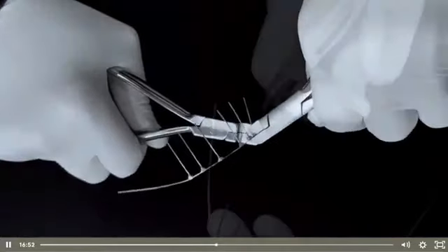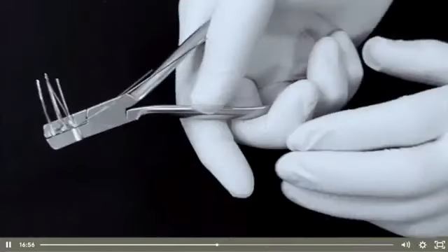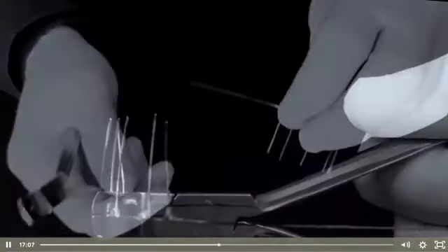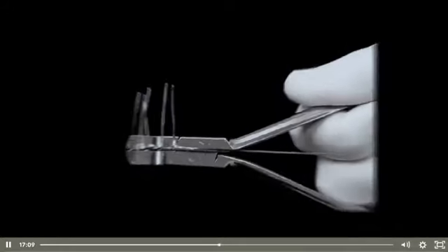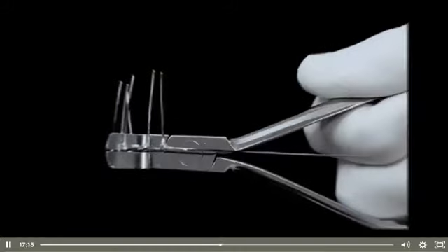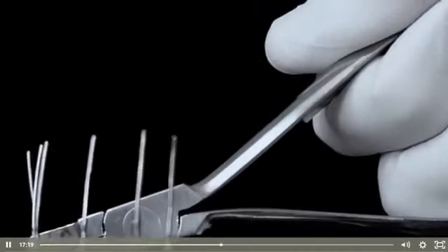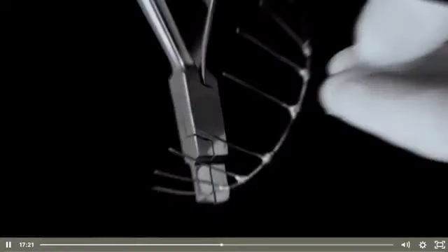When we grab the anterior segment with the pliers, and if we see this, we think that we really apply the torque, but it's not true because the anterior segment must be flattened. So when we flatten the anterior segment, we see that we went back to the same position. We have no inclination of anterior strips, no inclination. We just gave a negative inclination to the canine crown and positive inclination to their roots.